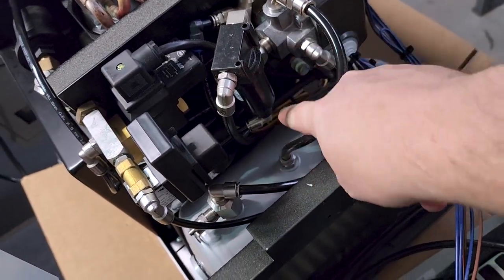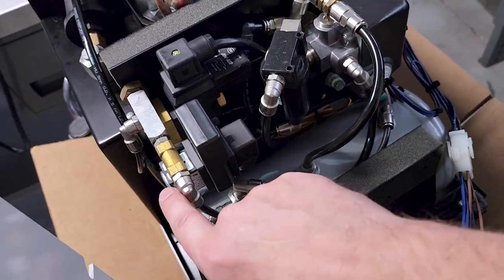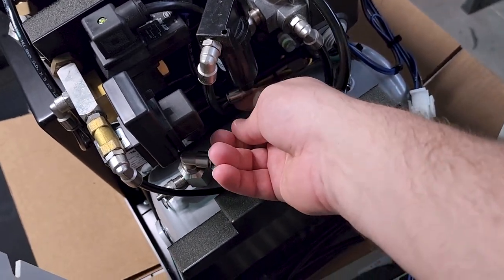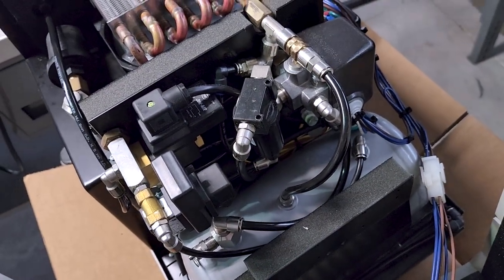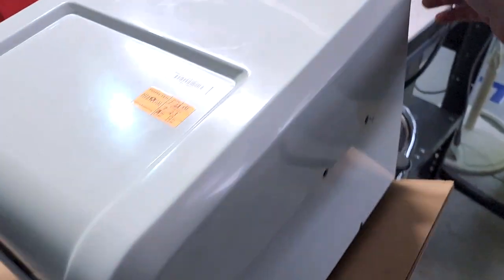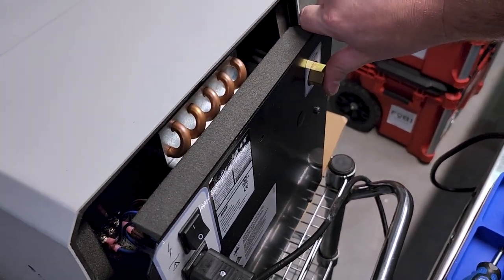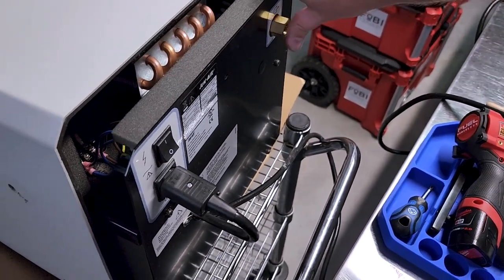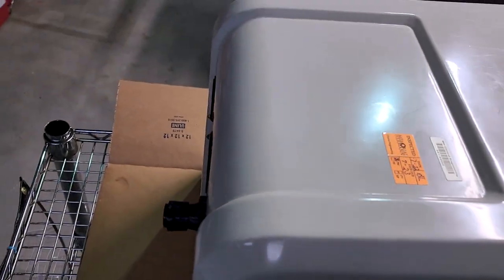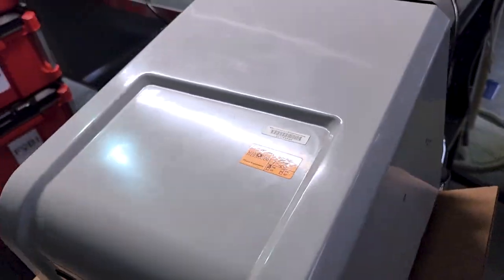And here you can see they have an auto purging water trap. So right there, I think that one comes down maybe up into one of these guys over here. But auto purging water trap. So you can see that it's plumbed. Very cool. Let's go ahead and turn it on and see what a cycle should sound like. So what you are hearing, if I were to block the compressed air on the exit, it's actually a super quiet compressor, right?